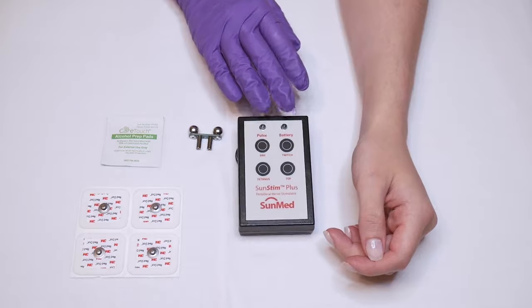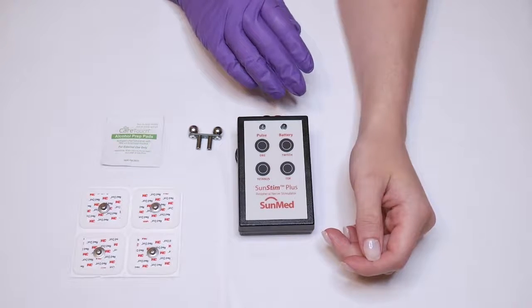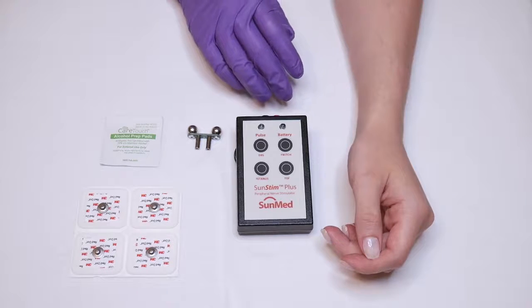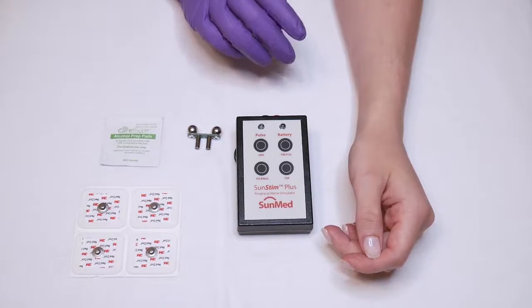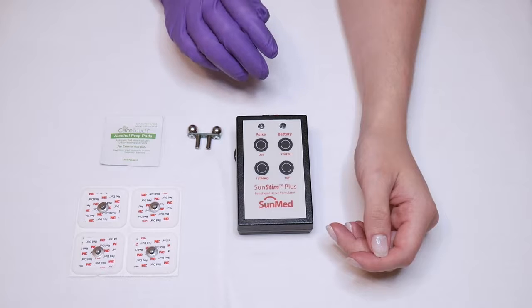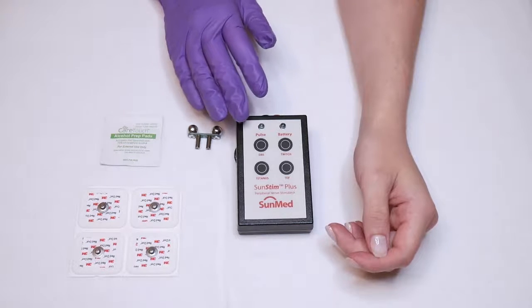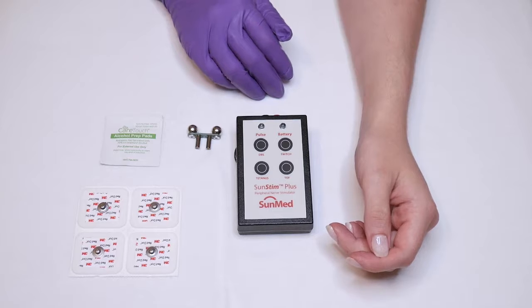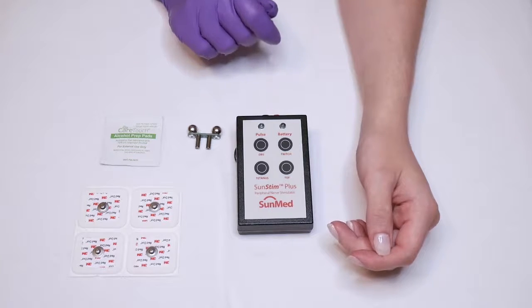Check the condition of the nerve stimulator and provided connections for proper functioning prior to each use. The nerve stimulator and all accessories must be visually inspected at regular intervals for any material degradation or battery leakage. This device does not require user maintenance or service except for periodic battery replacement.